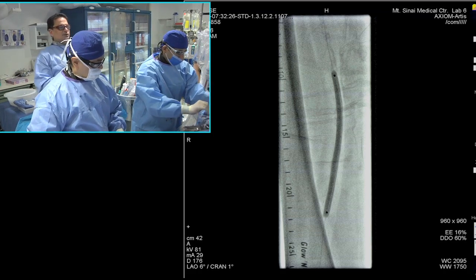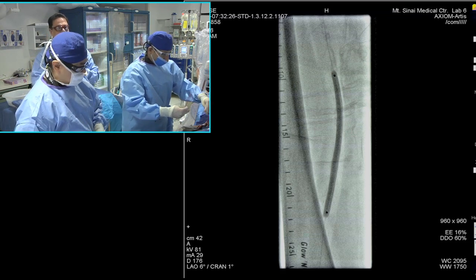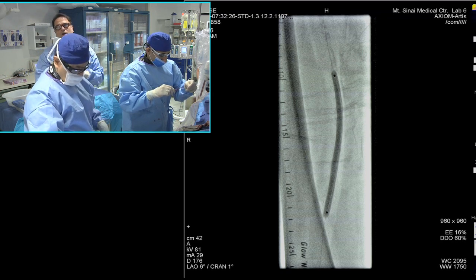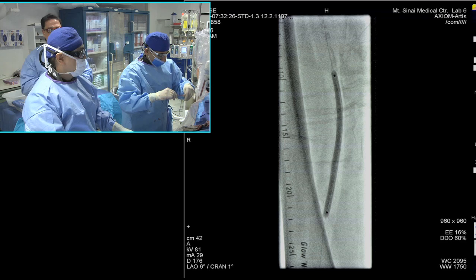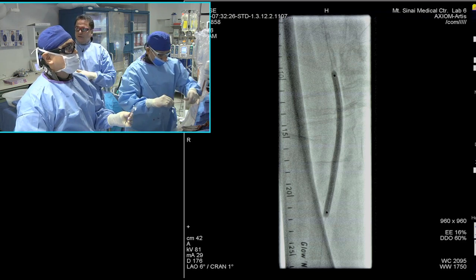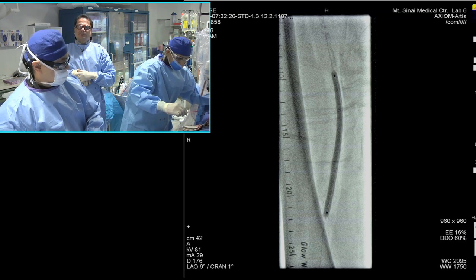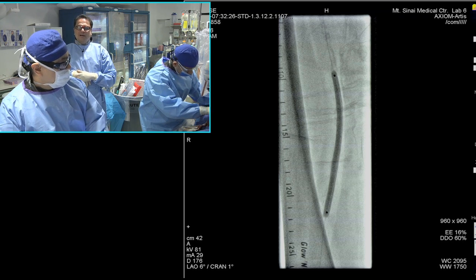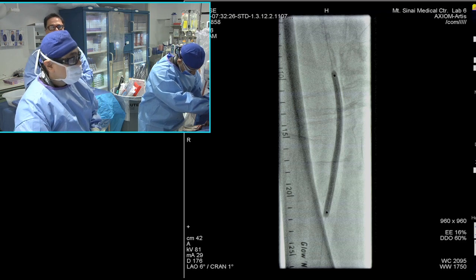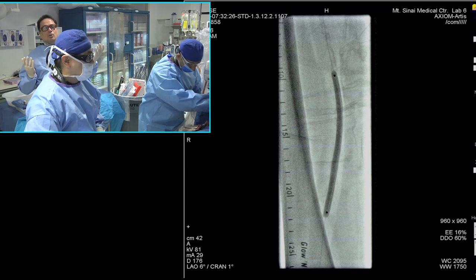So as far as vessel prep, other than that, I don't think there's any data that supports that. Like, I'll be honest with you. If you look at the IMPACT Global 150 patient cohort for long lesions, you had a 40% stent rate, as compared to 6 or 8% in the IDE trial. And the differences between the stent and non-stented arm were rudimentary. So I don't know whether this is saying that we don't need to do atherectomy in other than very heavily calcified lesions, because obviously these long lesions were also heavily calcified.